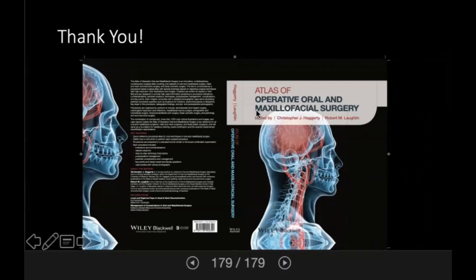I'm going to first start by saying that before we used guided surgery, that would happen every now and then. Now with guided surgery, as we discussed in that PowerPoint, we can significantly control the depth of our implant osteotomy and implant placement. You want to try really hard to not get a nasal perforation because that can be very difficult to close. You would start by removing that dental implant, potentially placing a collagen plug and then placing your xenograft in that area. You'd place the collagen plug to ensure that none of the xenograft or bone graft, as it was condensed, went up into the nasal cavity.